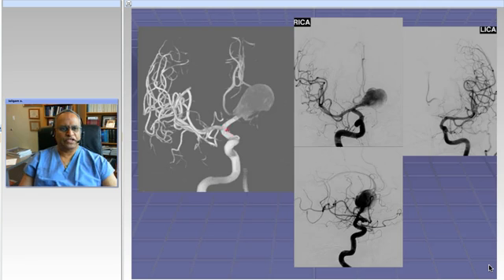So what happened? Here's the angiogram on the patient. It shows something that we already know. The right A1 is markedly dominant, the neck is very broad, and the A2s are around. What you don't see here is the thrombosed portion of the aneurysm, which all of this is thrombosed. The left A1 is just barely present, but as you'll see during surgery, there was in fact a little bit of flow from the left A1.